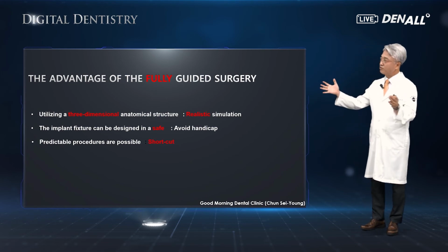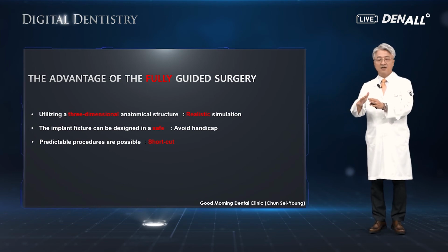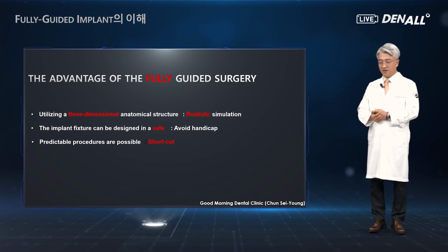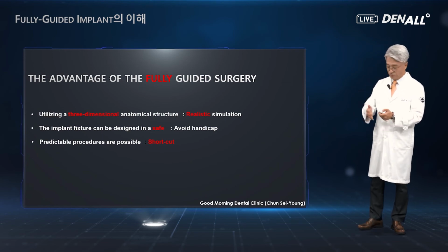So when we actually do the surgery on a patient, we can conduct the surgery in the shortest possible time, using the shortcut, giving least trauma to the patient.